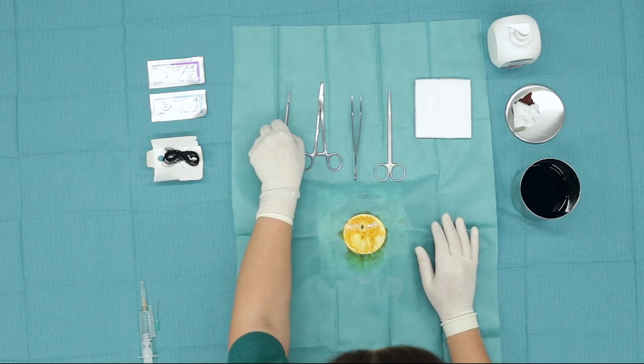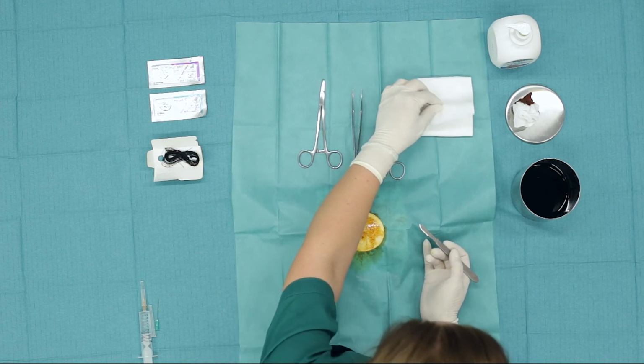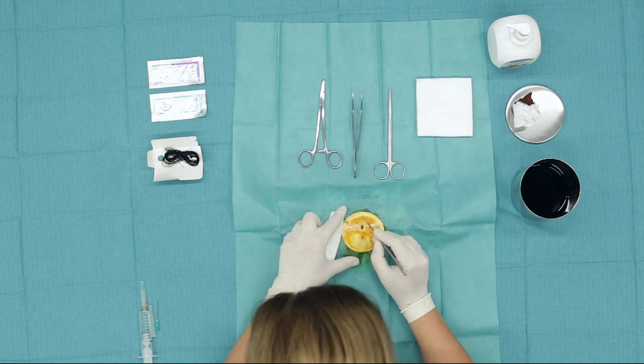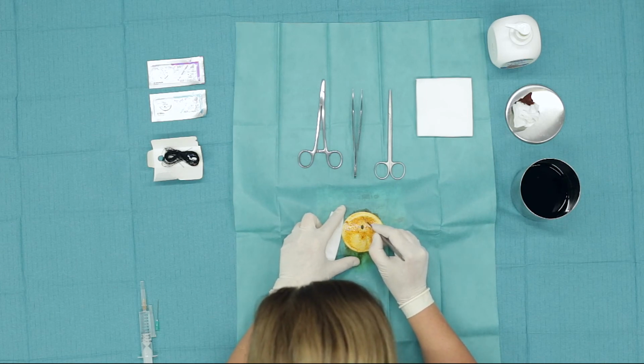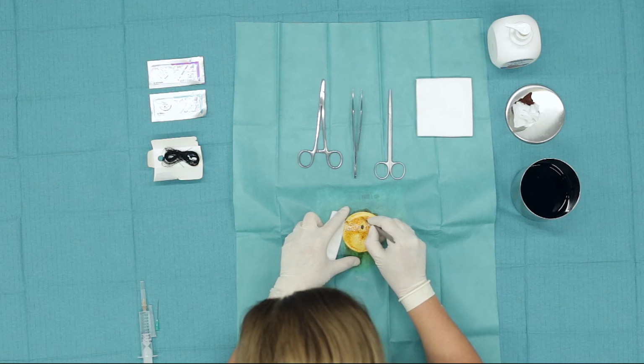I then proceed to the excision of the formation. I will make the incision spindle-shaped as we said, starting with the tip of the scalpel in the corner of the surgical wound that will be created.